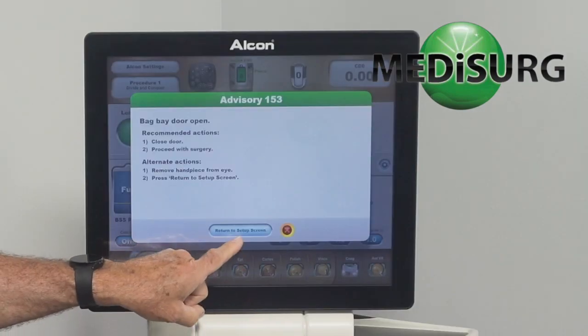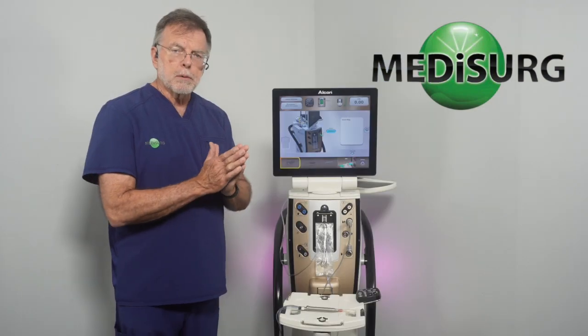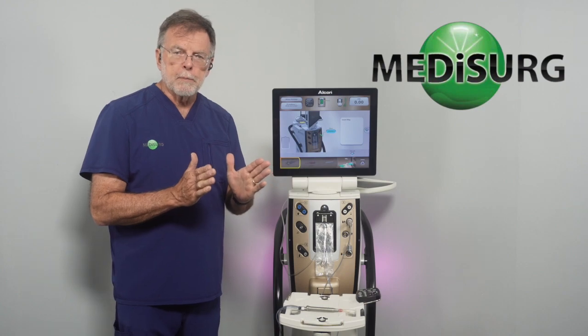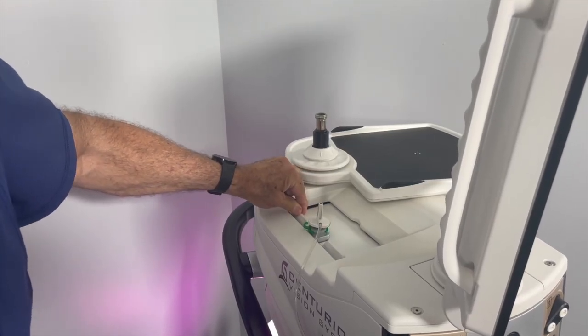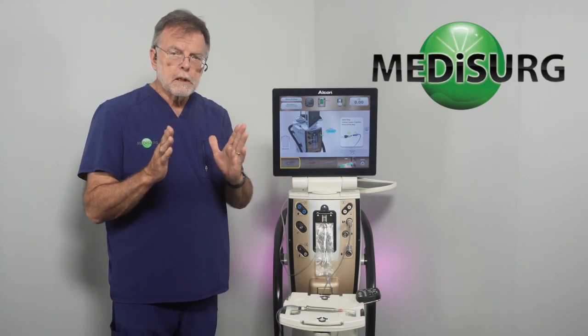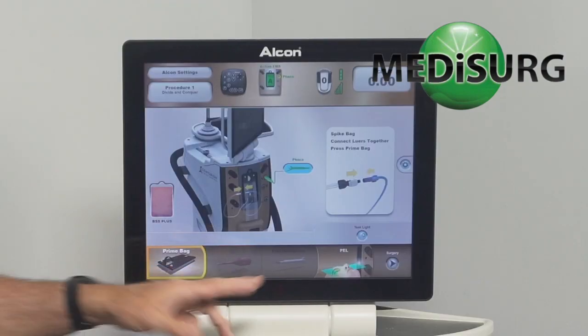But if you happen to push Return to Setup Screen, the pressure plates are now moving away from the bag. So I'm going to close the door. Now the door is closing, the pressure plates are coming back against the bag, and everything looks good.